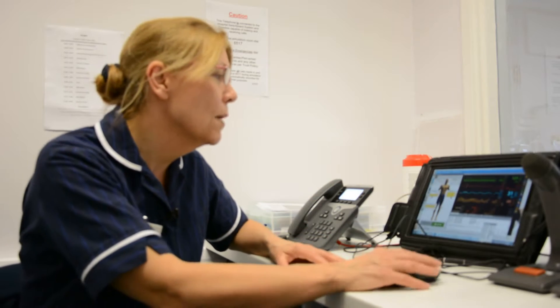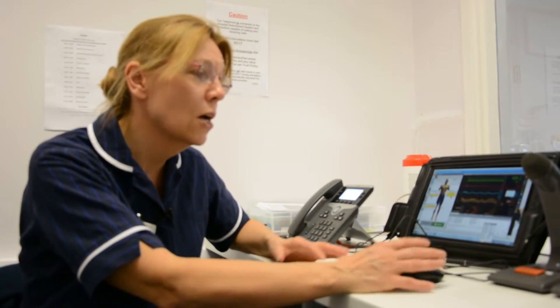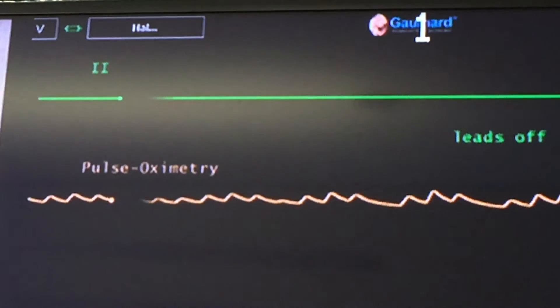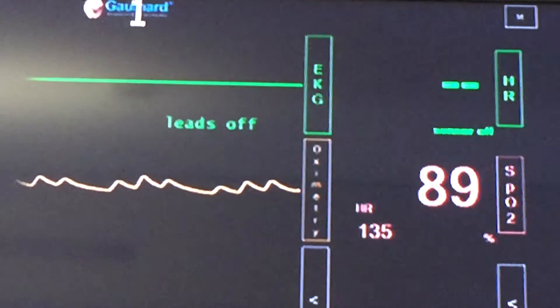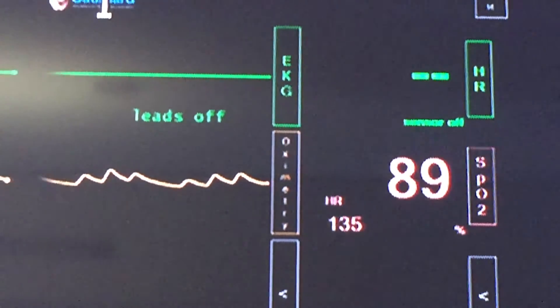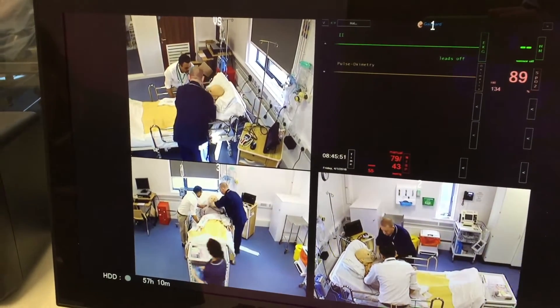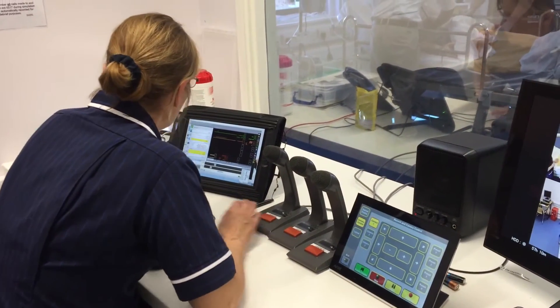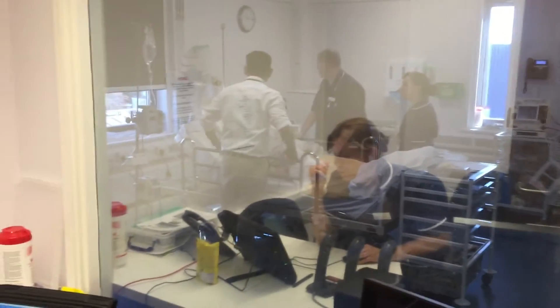On this computer here I'm able to change parameters such as the heart rate, respiratory rate, and oxygen saturation — making the patient get better if they do the right treatment, or if they're not doing the required treatment, the patient will deteriorate and they will have to manage that as they see fit, just like in normal clinical practice.